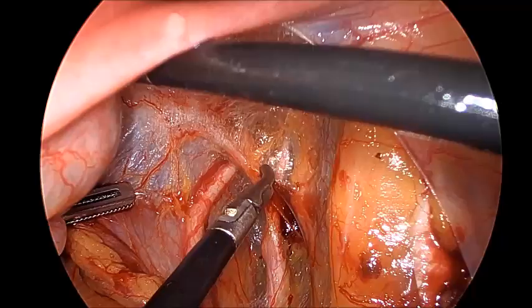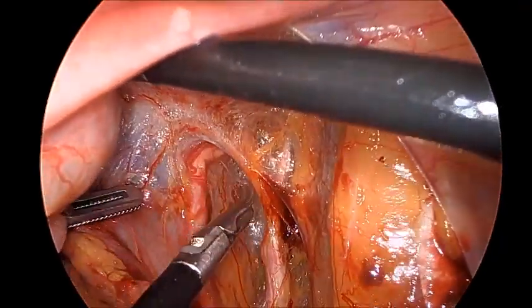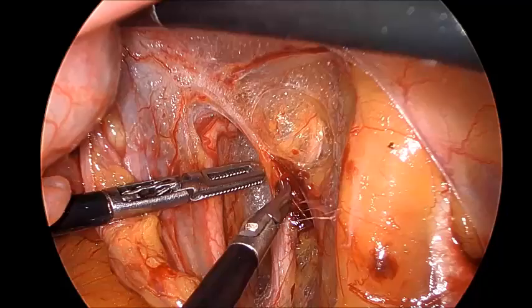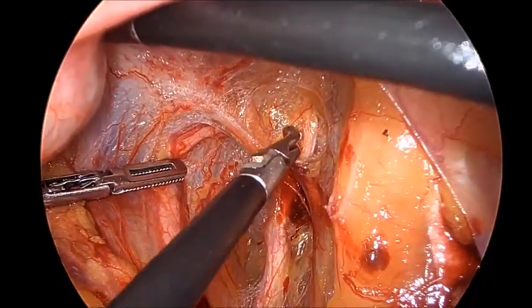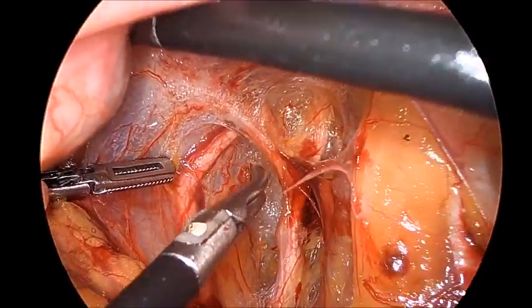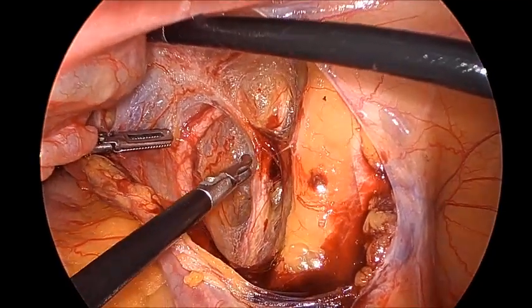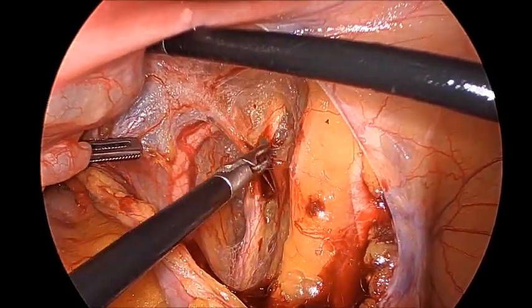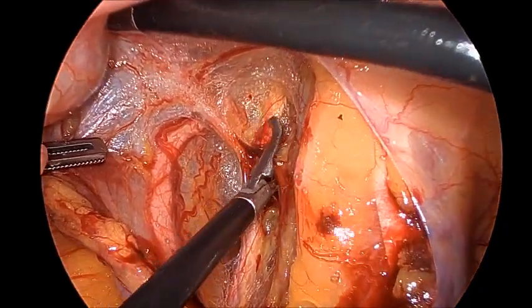Once we have identified it, try to free up the space so that we can coagulate the uterine artery at its origin. In a few obstetric emergencies, we might also have to coagulate the anterior division of the internal iliac artery as well.